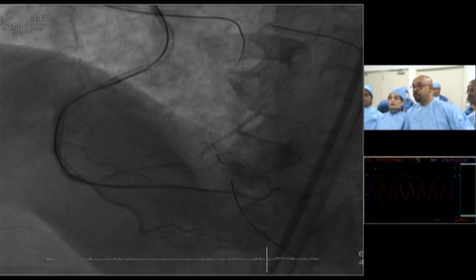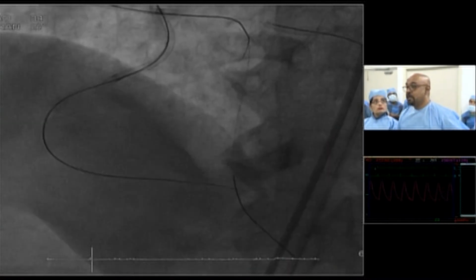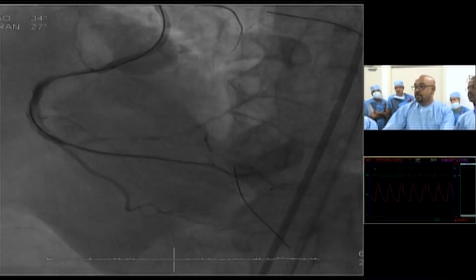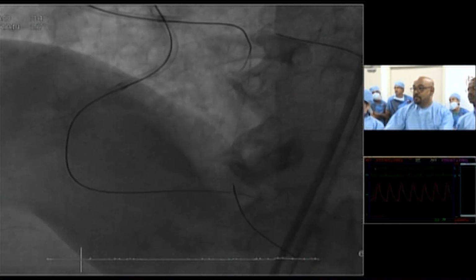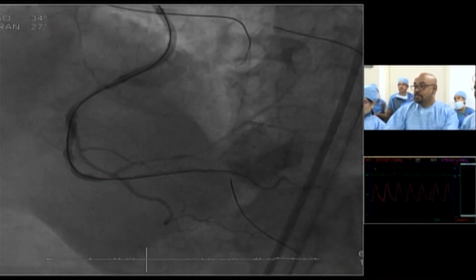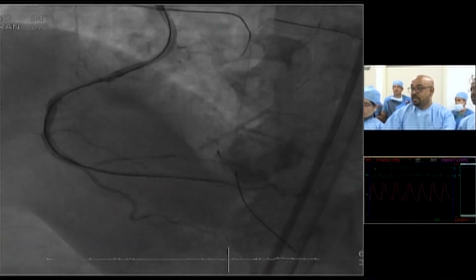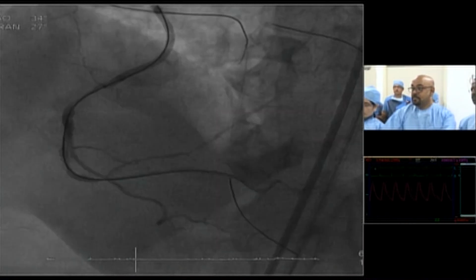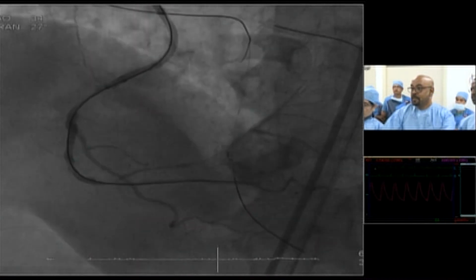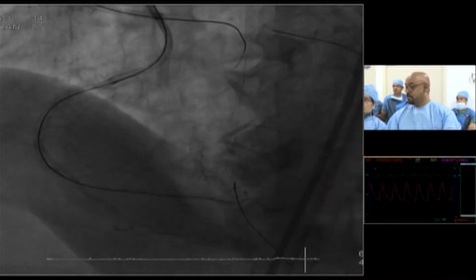So what do you think we should do at the crux? Should we stent it from the PDA upwards? Or I think you should go first cover the proximal segment, and then we will see. Maybe after a few months there will be remodeling and something will come. And also, it's just reperfused now. Underfilled, I would consider giving some nitro here, and giving even 5 minutes can make a difference. Just nitro and see how it looks. Not unreasonable.